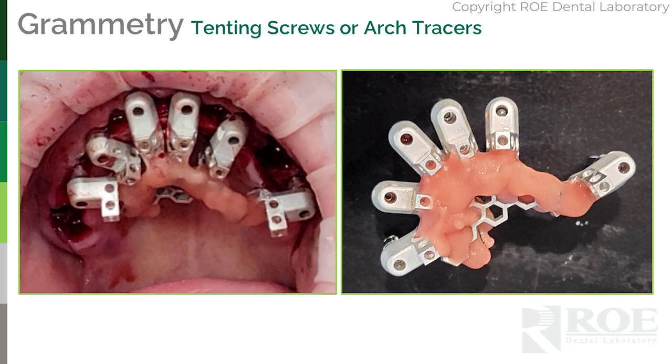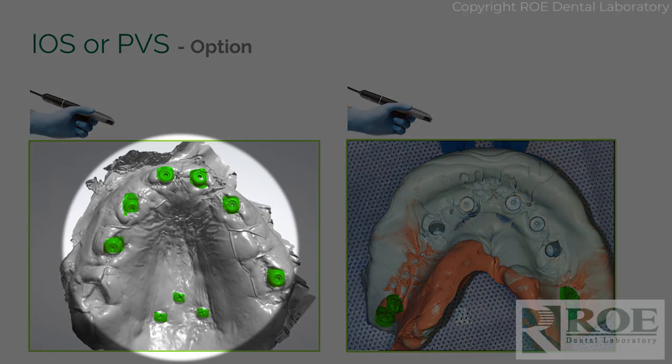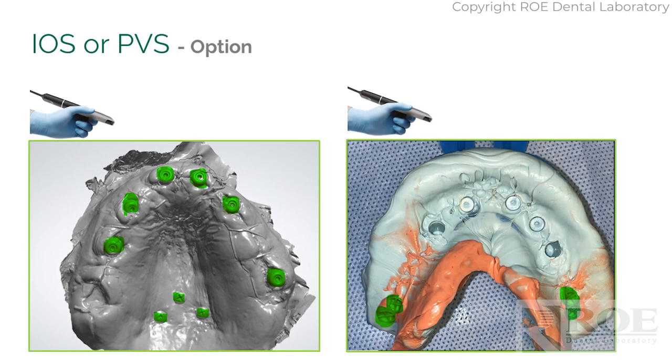The next step will be to scan the patient and pick up the healing collars and the screws, just like the image there on the left. Okay, scan away. When you scan, you're gonna make sure you always pick up the screws or we lose the bite. Okay, the screws will bring us back to the original scan. If your scanner is struggling, if you're struggling that particular day with capturing this, be prepared with a stock tray and a lot of impression material and pick it up.